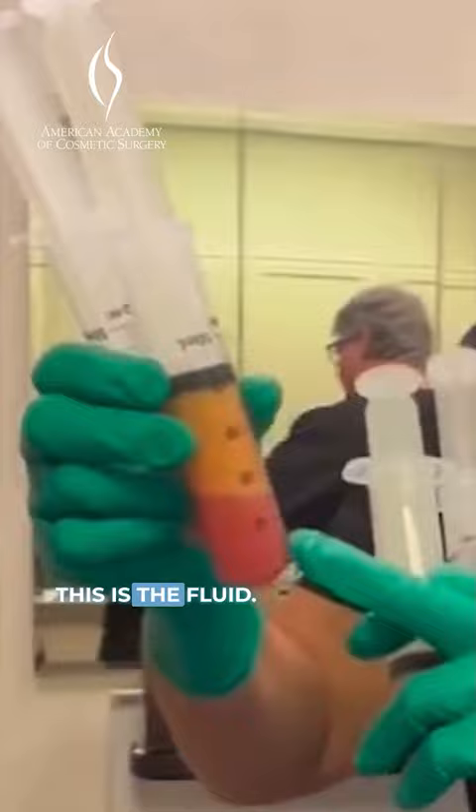This is fluid, and this is pure fat — 100 cc. Syringe lipo — use it just for touch-ups. Mandel Brown Plastic Surgery Center.